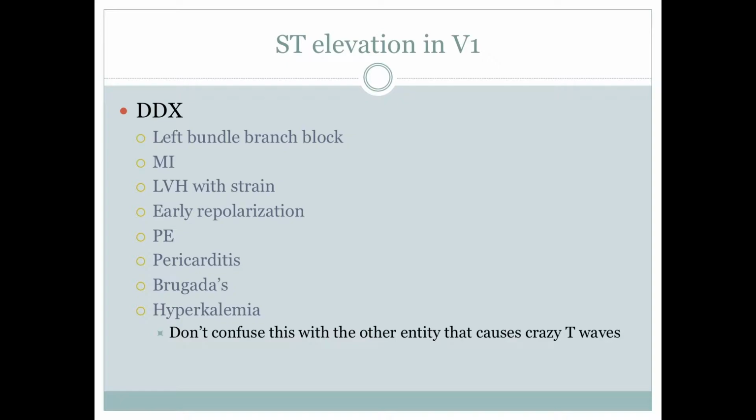And that's really about it, I think. Also, with these changes, this is something that we see typically with our ESRD patients, but there are other electrolyte abnormalities that can be caused from missing dialysis. Something that we don't see as often is something like hypocalcemia, which could present as QT prolongation because the calcium-dependent conduction through the myocytes tends to be slowed due to the lack of calcium.